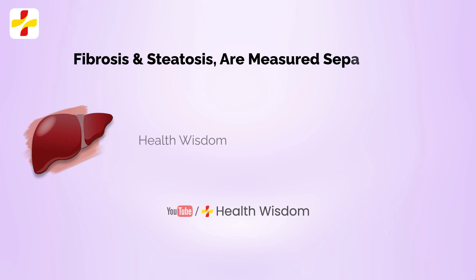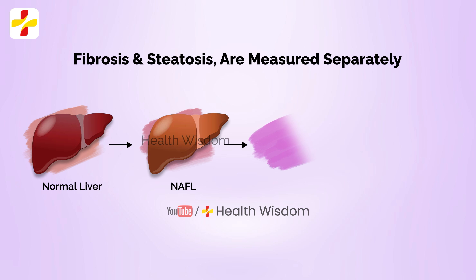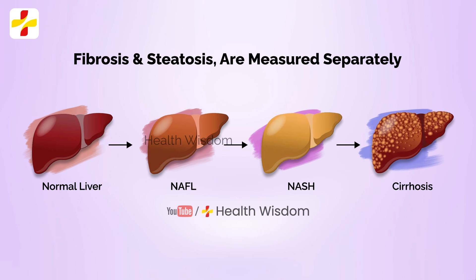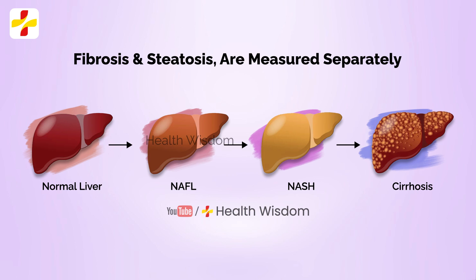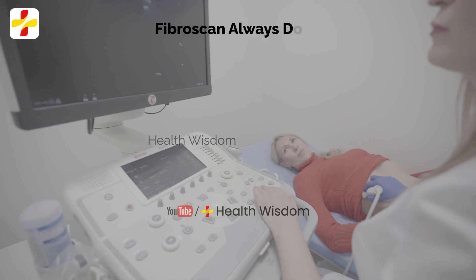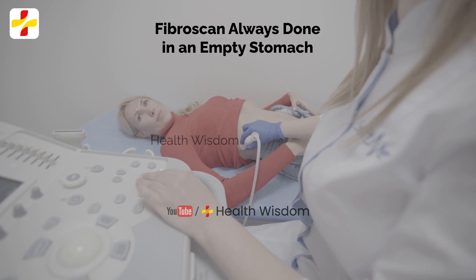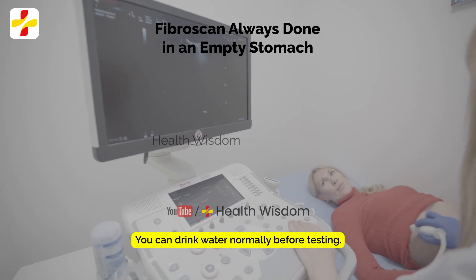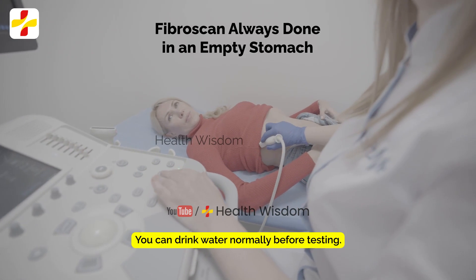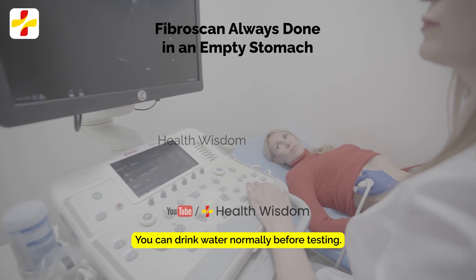Fibrosis and steatosis are both measured separately from one another. Your doctor will talk with you about your results during your appointment. Fibroscan is always done on an empty stomach to get a better report of the liver. When you go for a Fibroscan, you should do it in the first half of the morning — between 8 and 10 AM — with an empty stomach. You can drink water normally before testing.